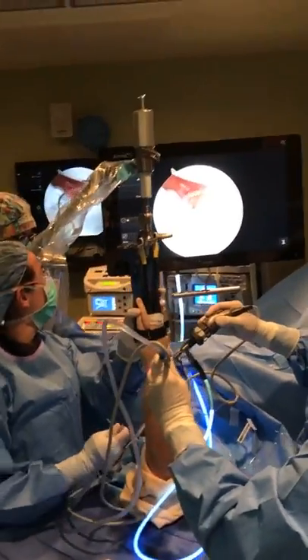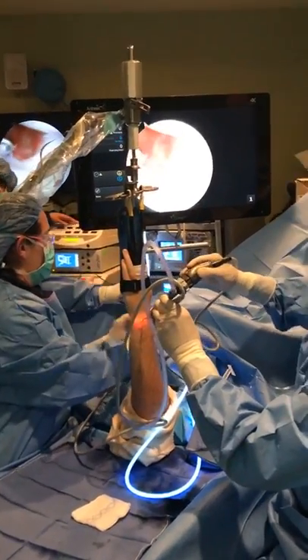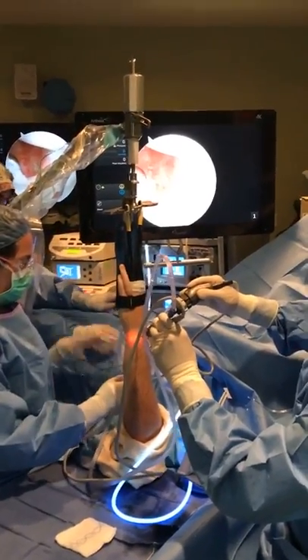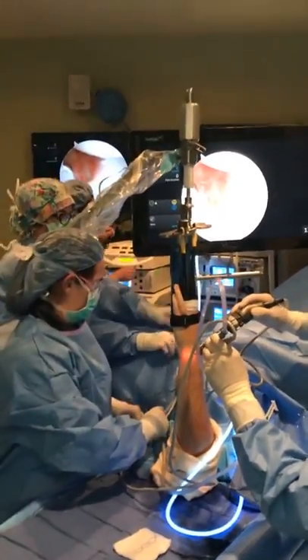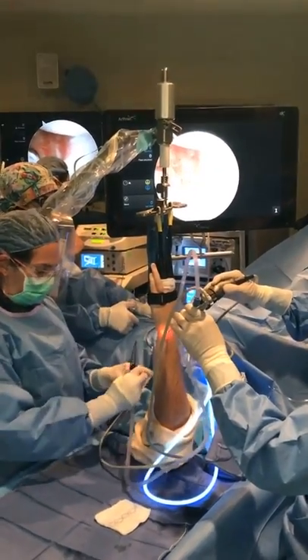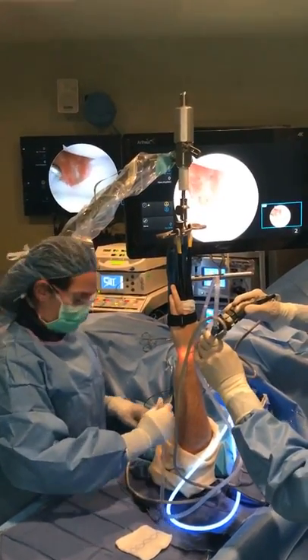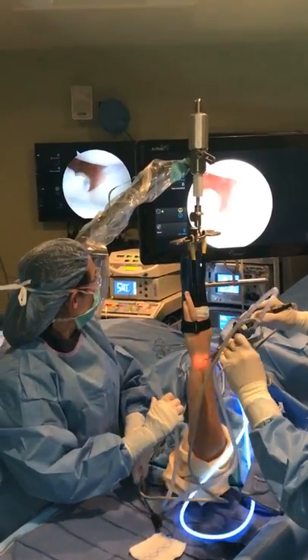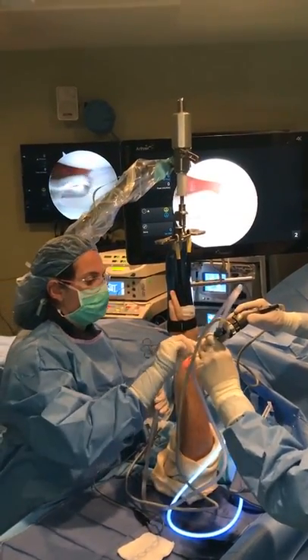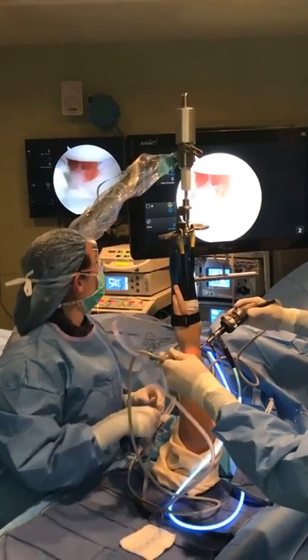But look how inflamed this is. I mean, granted, this is the advantage of having a procedure with somebody who's done, I don't know, 1,000 of these. And so I'm used to seeing what's normal, what's abnormal. This is very abnormal. I mean, that's very inflamed, that red. So I'm recording a picture. So every time Kate allows some suction, that whole structure is lifting up.